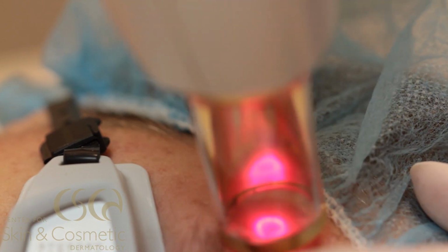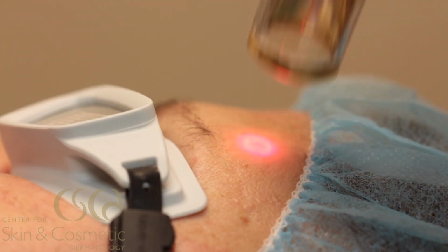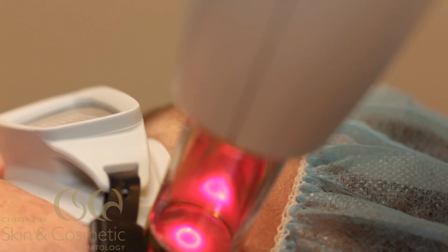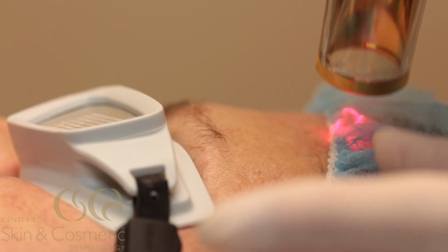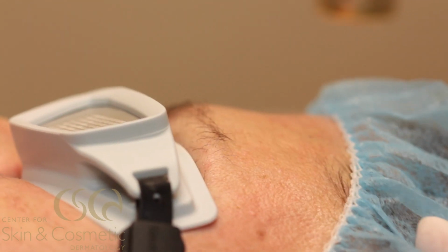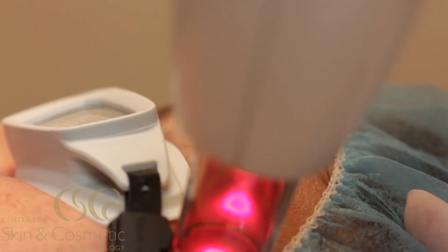If you have resistant pigmentation and you've taken all the necessary steps through chemical peels or intense pulse light therapy procedures, the fractional procedure can clean up anything that's left over because it's going a lot deeper into the tissue. For the resurface photofractional part of the procedure, that will run about 30 to 45 minutes, depending on if we're doing any baseline treatments or spot treating for acne scars or deeper wrinkles such as vertical lip lines or crow's feet around the eyes. If we add that additional pass, that will add on additional time for the procedure.